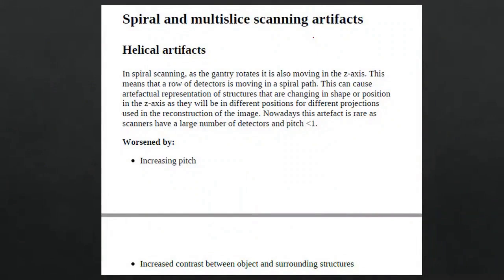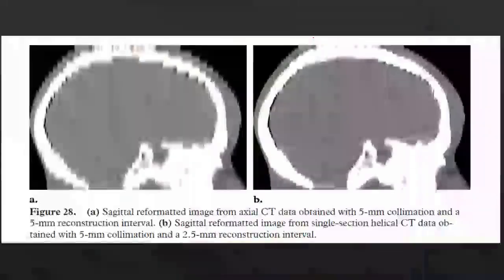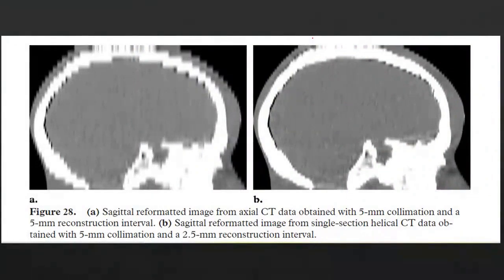There are some artifacts that are also related to the images, which are 5 millimeters and 3 millimeters. We always work with what is usually 1 millimeter with a low thickness. When you create a sagittal and coronal reconstruction, the images start to show the existing artifacts. The artifacts are a result of you having created a large slice thickness.